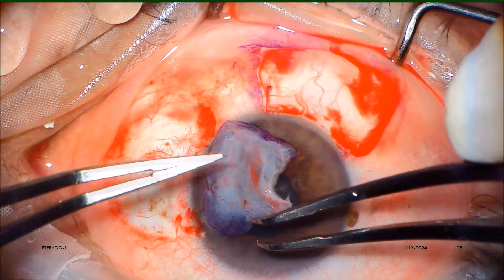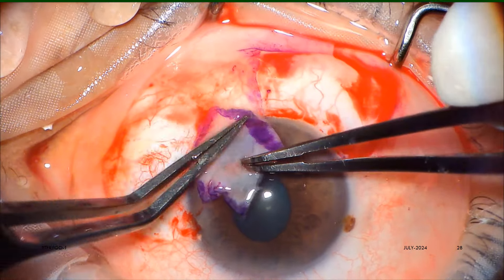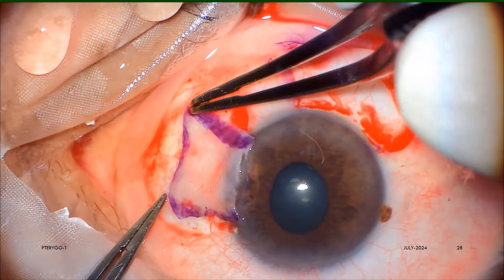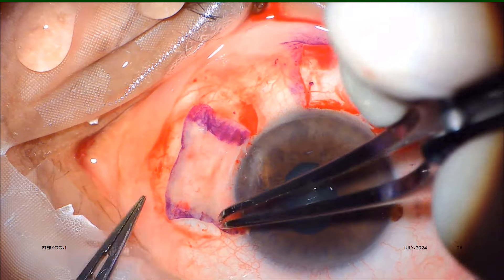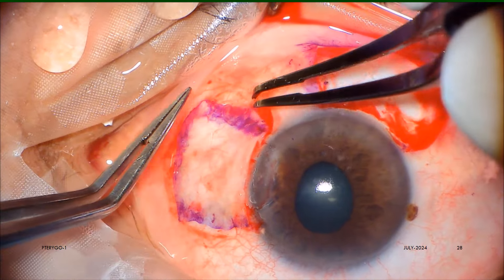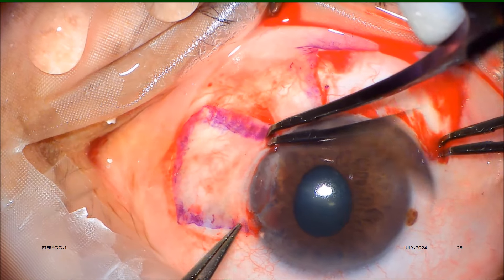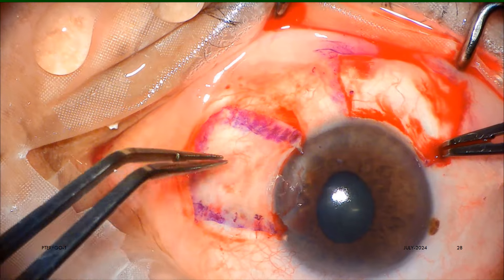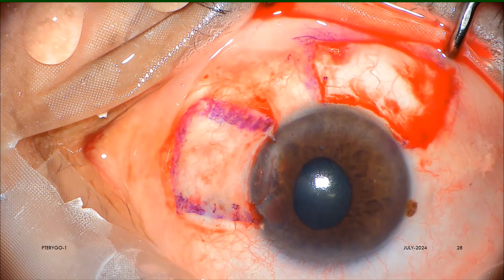Using a Colibri and McPherson forceps, the flap is inverted so that the epithelial surface is now facing upward. The flap is brought and set into its seat or pit, always keeping the donor site limbus oriented to the recipient site limbus. With McPherson forceps, a sort of multipoint acupressure is applied to the flap to make it stick to the scleral bed.